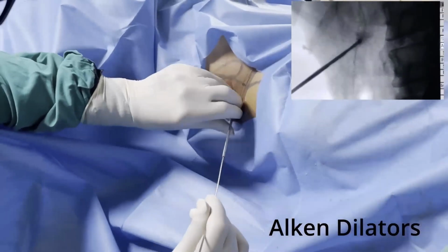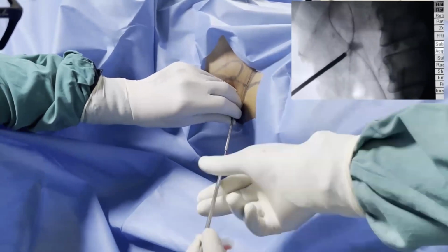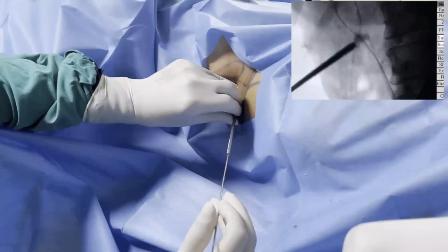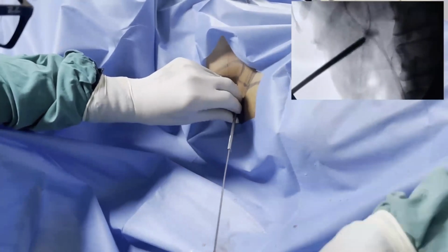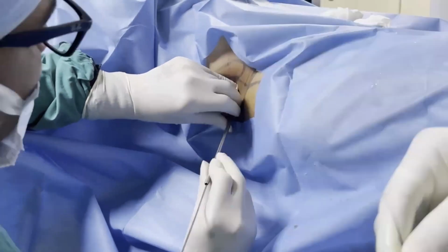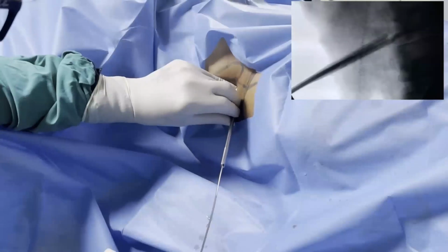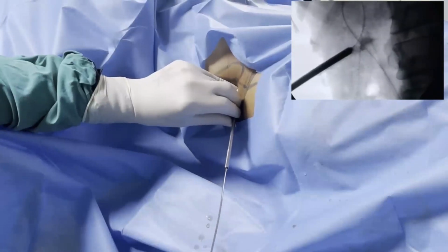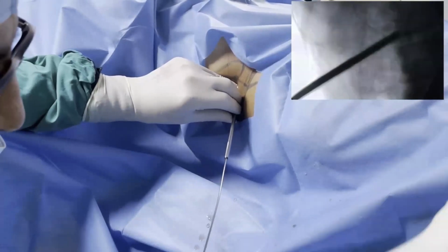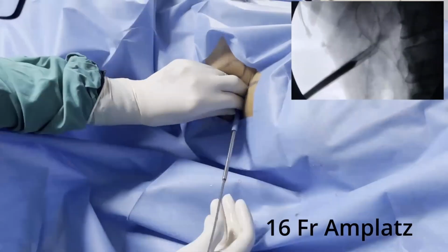After placing the guide wire, we advance all the metallic Alken dilators. Usually we do 14 French and 16 French punctures routinely for the tubeless supine PCNL, if the stone size is less than 20 mm. So here we have dilated a tract. We have inserted 3 metallic dilators. Then after that, we are placing a 16 French Amplatz sheath over the dilators.